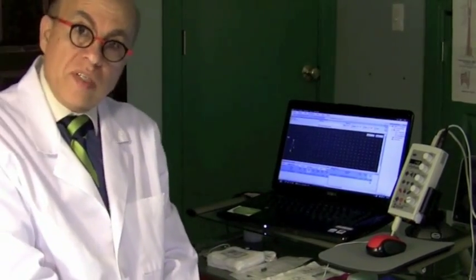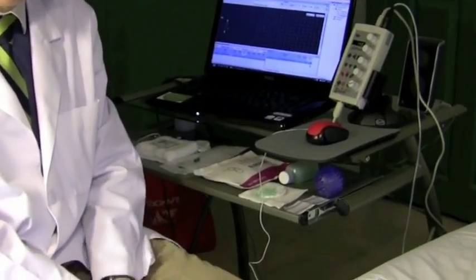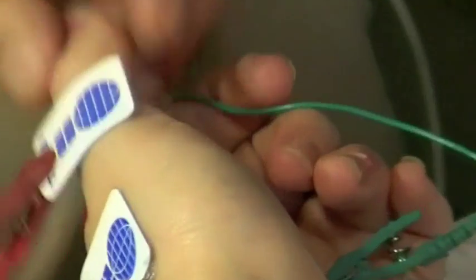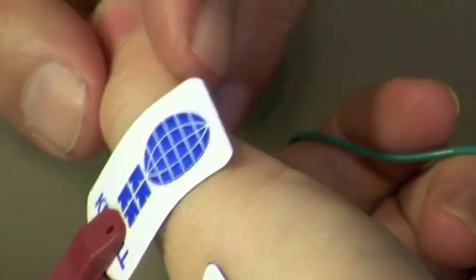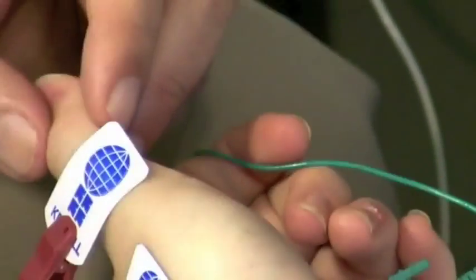We're done with the sensory studies, so let's now do the motor studies. We do the median and the ulnar. For the median nerve, we record from the abductor pollicis brevis muscle. We call it fondly the APB. Abductor pollicis brevis, abductor means it spreads. Pollicis in Latin means thumb. Brevis means short, because there's a long abductor and there's a short abductor.